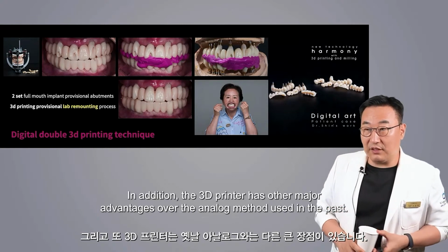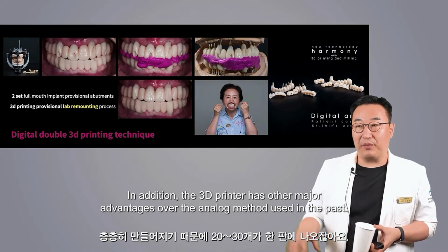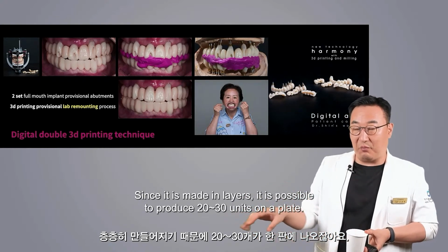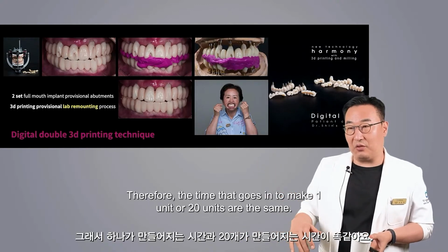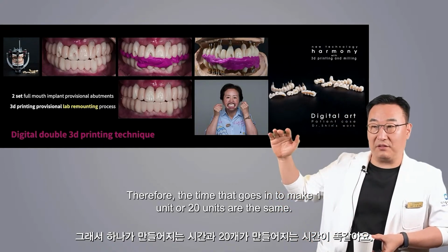In addition, the 3D printer has other major advantages over the analog method used in the past. Since it is made in layers, it is possible to produce 20 to 30 units on a plate. Therefore, the time that goes in to make 1 unit or 20 units are the same.